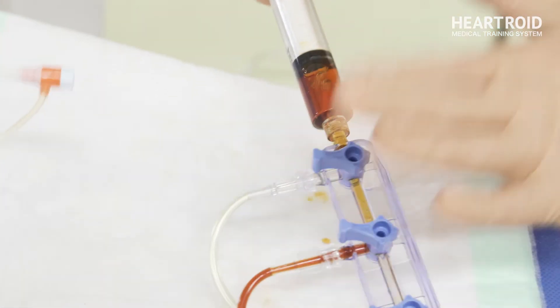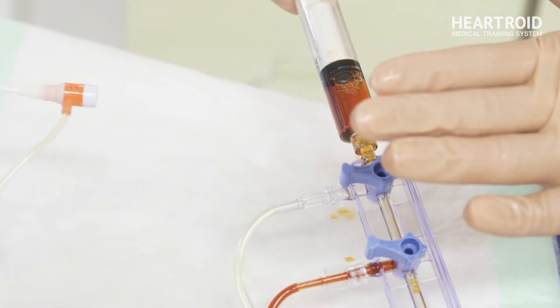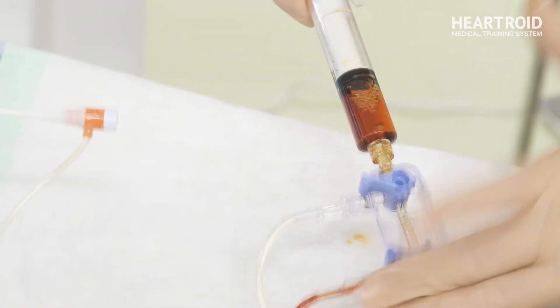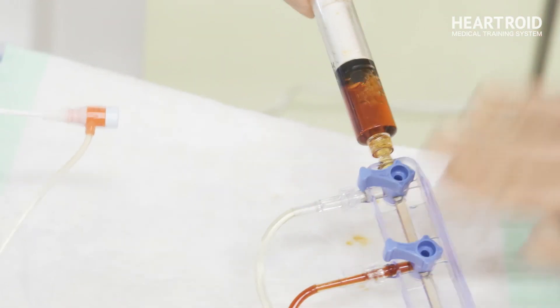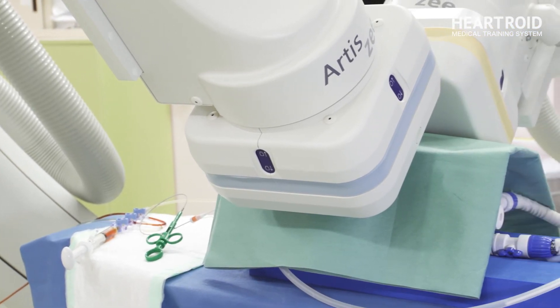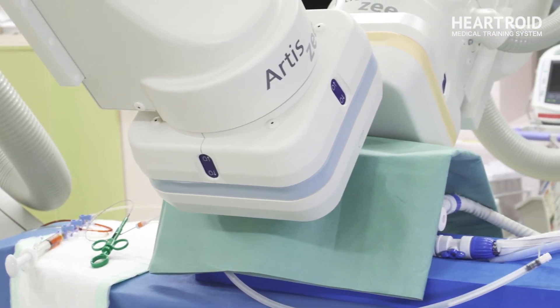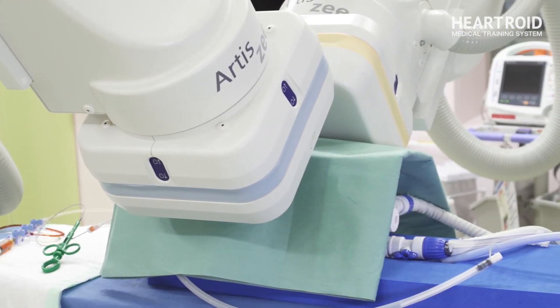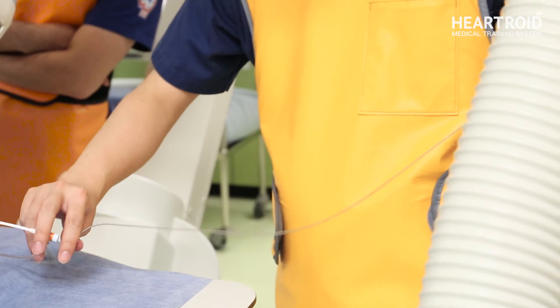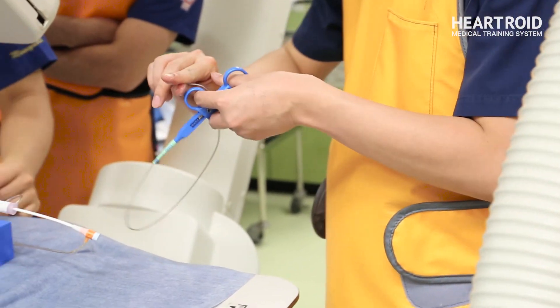Finally, let's try the full procedure under x-ray fluoroscopy by covering the tank with a drape.